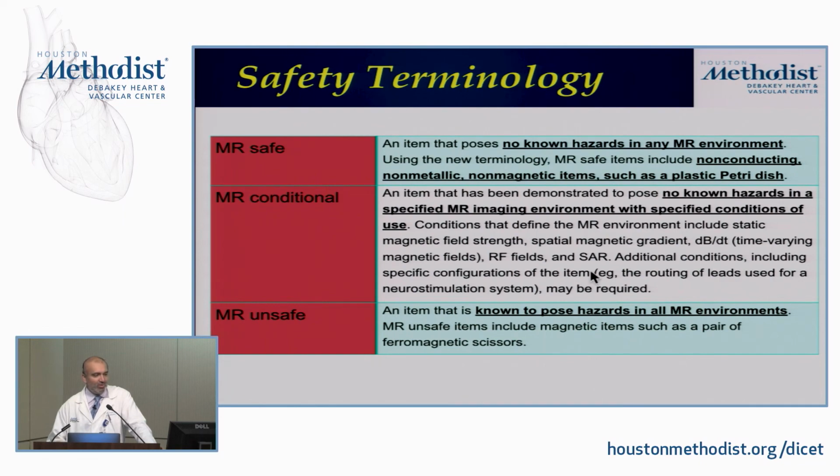And the reason for this MRI conditional nomenclature, because in the past the FDA used to use MRI safe and unsafe, is because we don't know all the possible scenarios: the strength of the magnetic field, the location of the specific device, the type of imaging sequence that you're utilizing, and whether there are other devices the patient may have that may interact. There are so many different interactions that can occur that there's no way you can possibly know all of them. And that's why they use the terminology conditional, to say that at least in the set of conditions that we've tested it in, it appears to be safe.